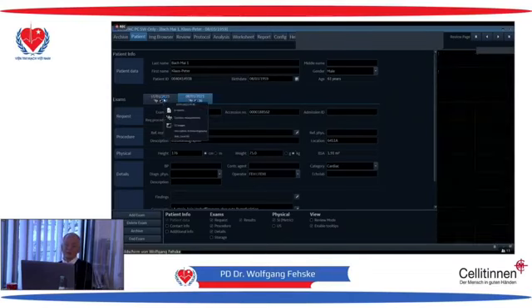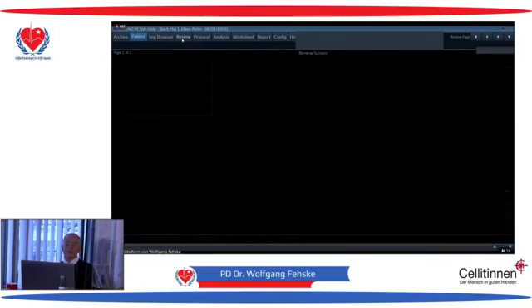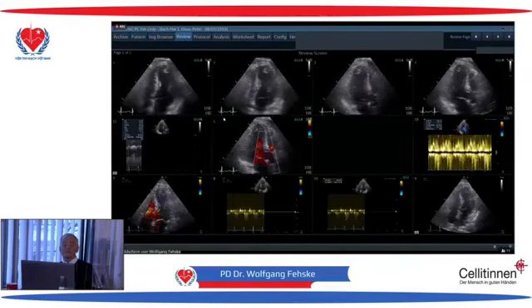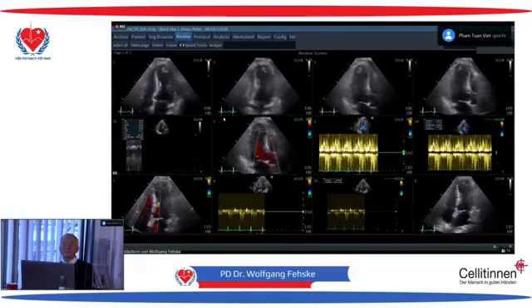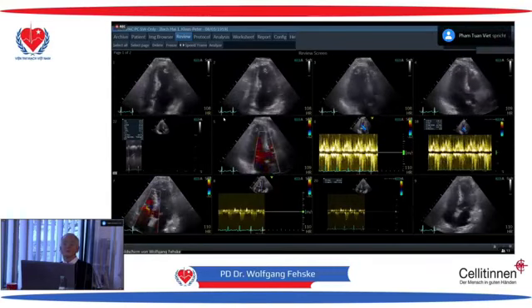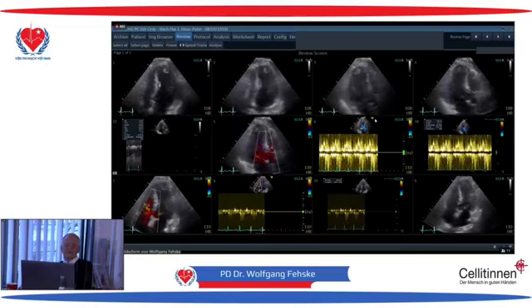Just to complete that, what you see, this is just yesterday that I had the re-examination post-operatively in the patient, and look what happened. You see what happened? What is your idea? We have thrombus. Yeah, apical thrombus. It is terrible.